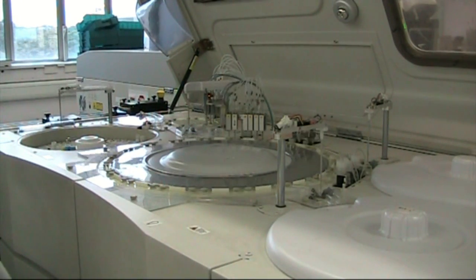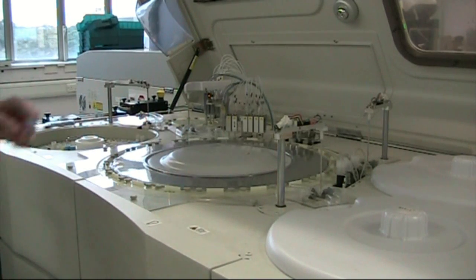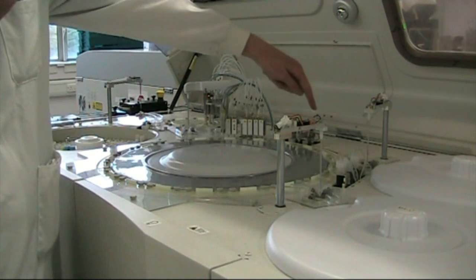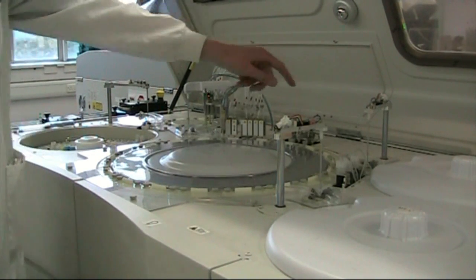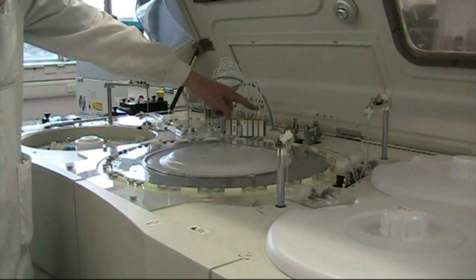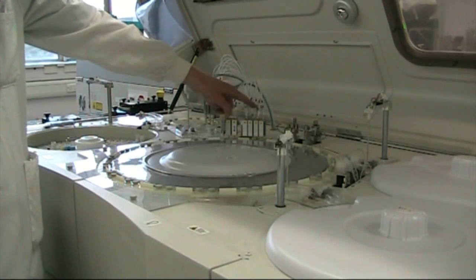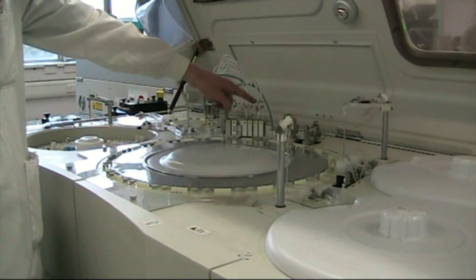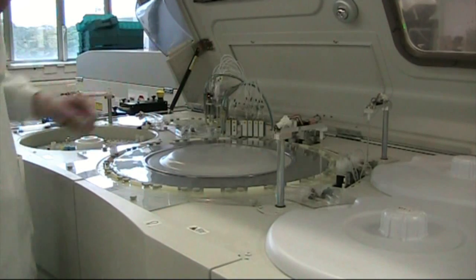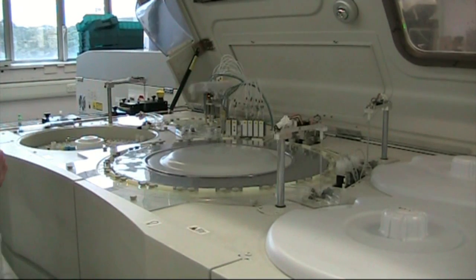After 5 minutes, the sample will be in the right position for the reagent 2 probe to put reagent into the cuvette again, and it then goes through mixing. So we've got a mixer 1 and a mixer 2 here, which come out and vibrate backwards and forwards and spin around very quickly in the cuvette. You can see that now. That ensures that the sample is mixed effectively.